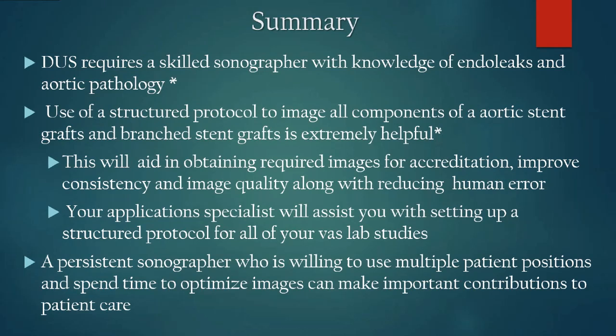Use of a structured protocol to image all components of an aortic stent graft and branch stent graft is extremely helpful. So our lab uses a structured protocol, and like I mentioned before, we use custom presets, but using a structured protocol will aid in obtaining required images for accreditation, improve your consistency amongst your team, and image quality, along with reducing human error. You're going to continue to obtain the correct images on every study.